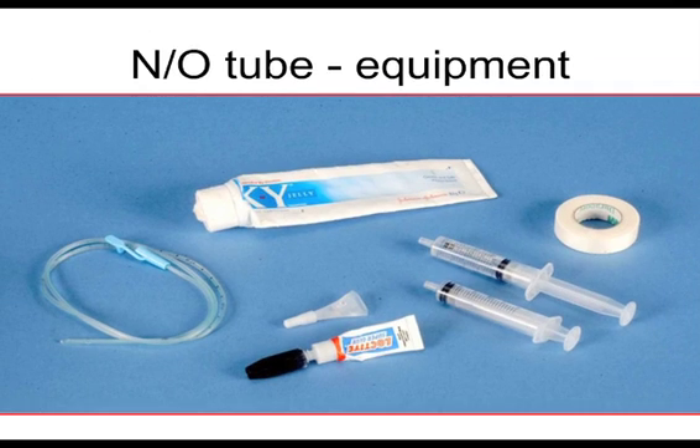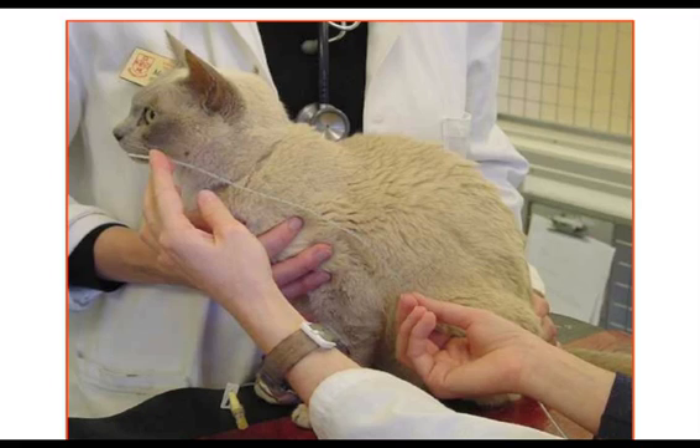So let's have a little go through what we do in these patients. Measure your tube — as in all these cases, to the last rib, or around the ninth rib is ideal. We want this to sit in the distal esophagus.